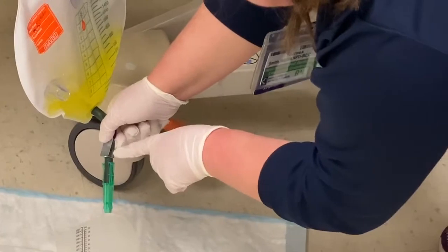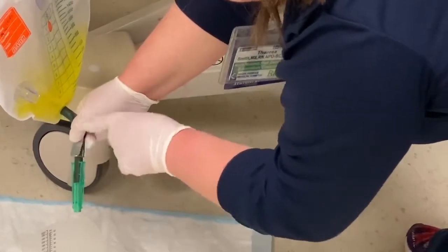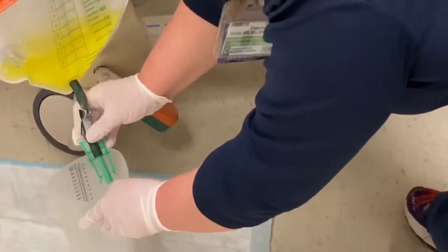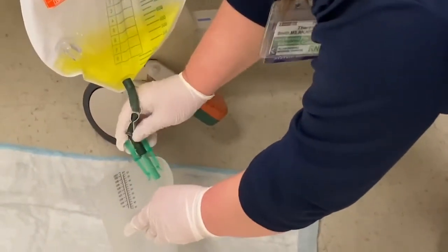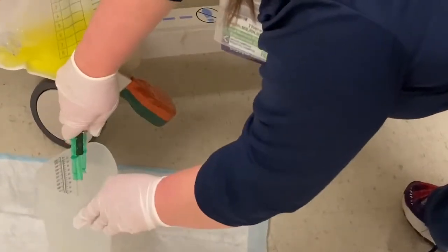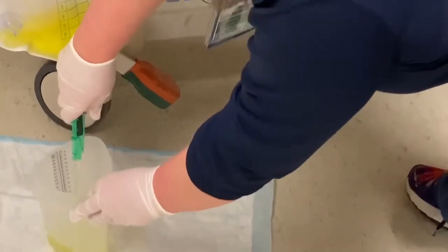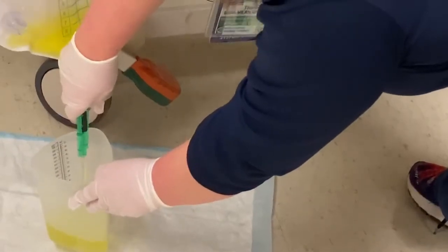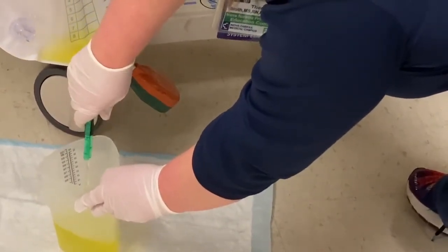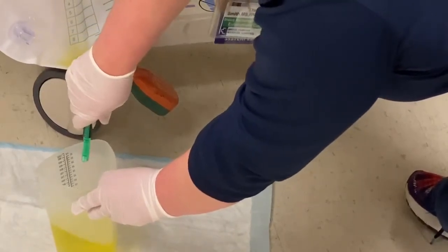The way you unclip this is you actually push down on that little ledge, but you always wanna have it over the canister when you unclip, because as soon as you do, urine will come out. I don't have a good grip on there, let me fix that. All right, I wanna make sure that my spout does not touch the canister because I don't want it to be contaminated. And I'm gonna let all of the urine in the bag drain out.